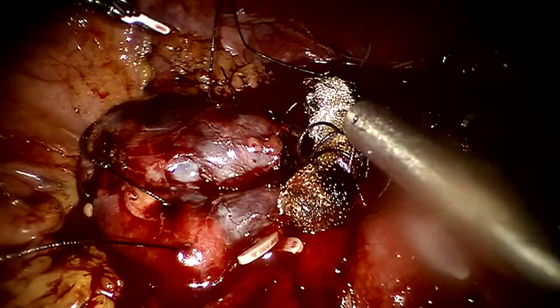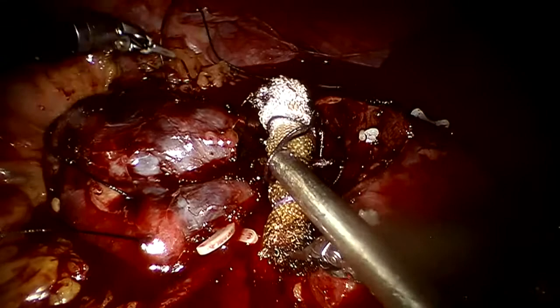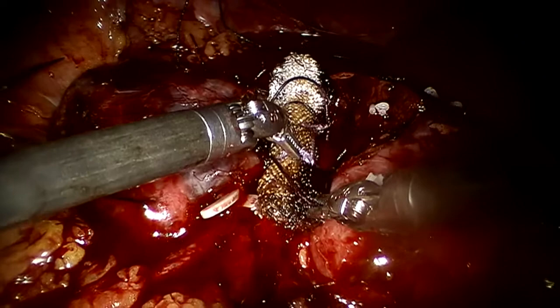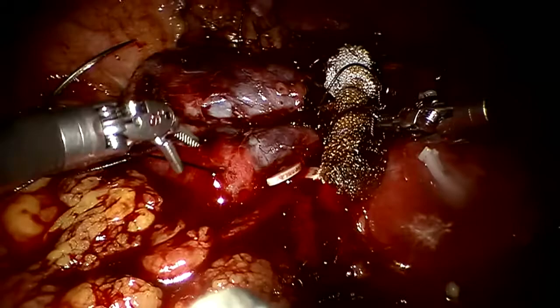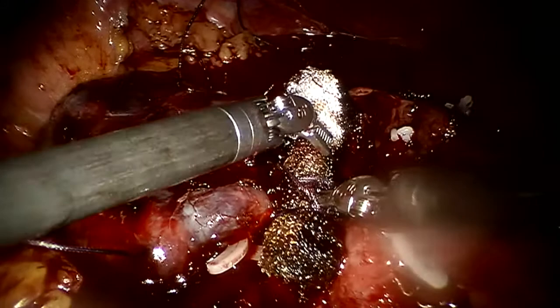So just little things that inspire confidence. I'm just trying to make sure each stitch is appropriately going down here. See now, if this stitch tying the bolster was white, then there would be no confusion between this and this, right? So again, it's not a big deal, but it just leads to intraoperative efficiency. Thank you for this detail, it's very important.